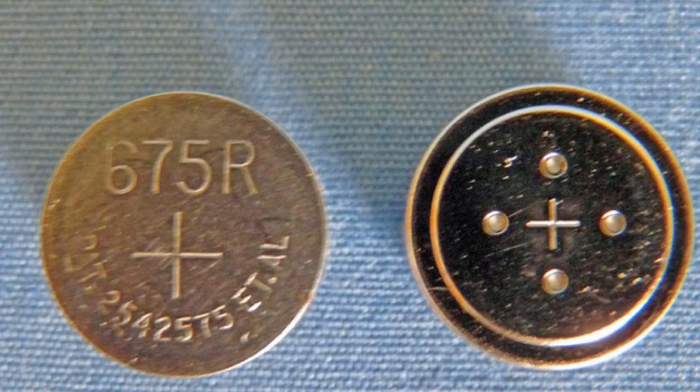However, when we shifted to the transistor era, the transistor hearing aids had much lower voltage requirements, and that's where we saw the emergence of the button batteries. The biggest battery available for current hearing aids, the 675 battery, was introduced in the early 1950s. They were not zinc air at the time. Hope you could see the difference between the two. The older ones don't have the holes to let the air inside.